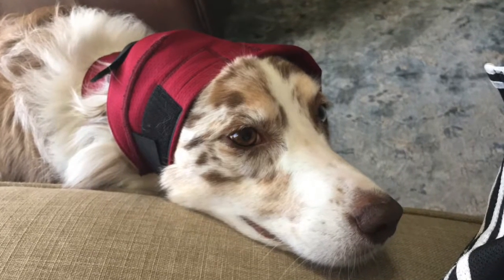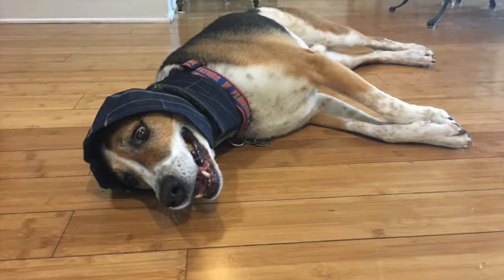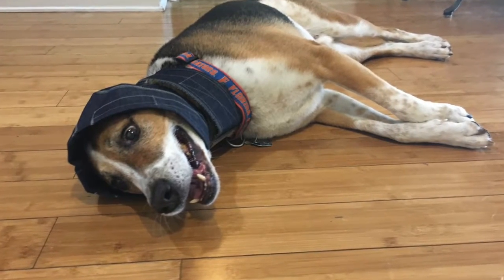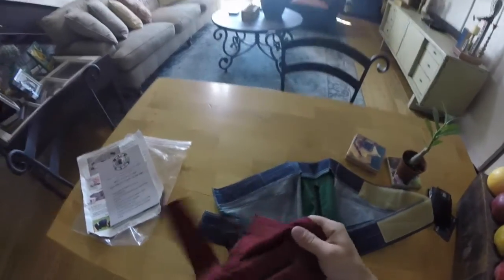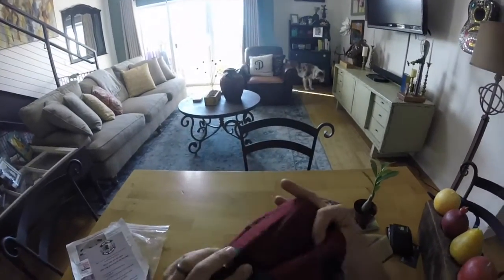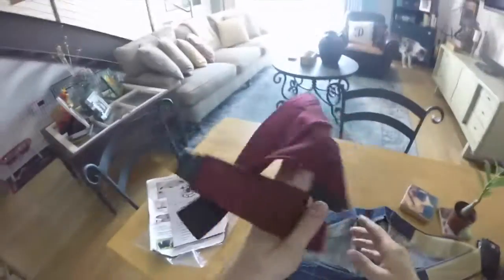For aural hematoma specifically, she has people use this no-flap ear wrap as opposed to a traditional e-collar. The big cone of shame is going away — it'll be replaced with more comfortable, flexible, less stressful devices like the no-flap ear wrap.